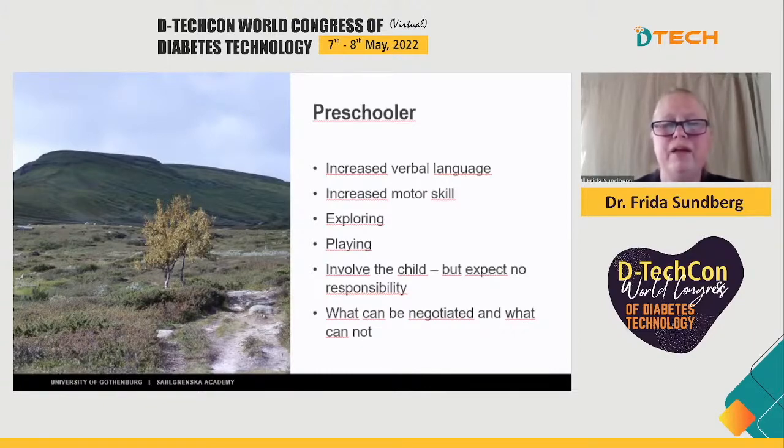So CGM with automatic transfer of data to the parent's mobile phone might give some good freedom to the child. And it also gives the child a possibility to go and play with friends and stay with grandparents, and the parents can support from a distance. You need to involve the child in the treatment.